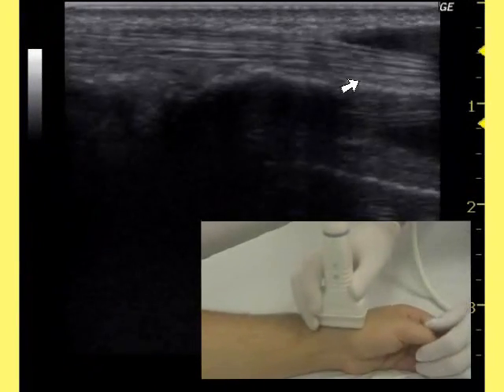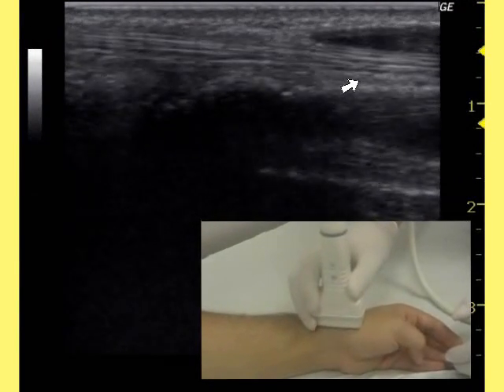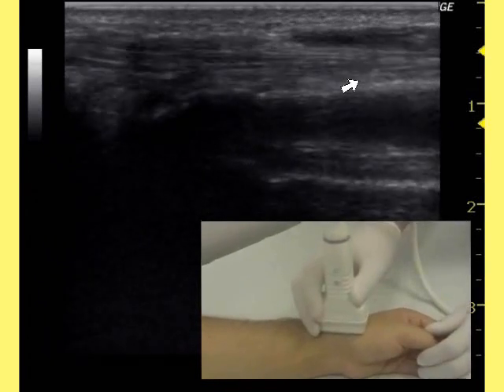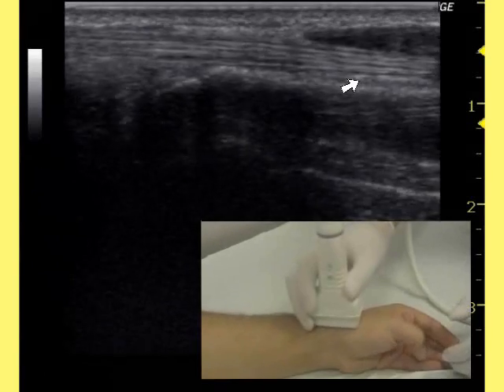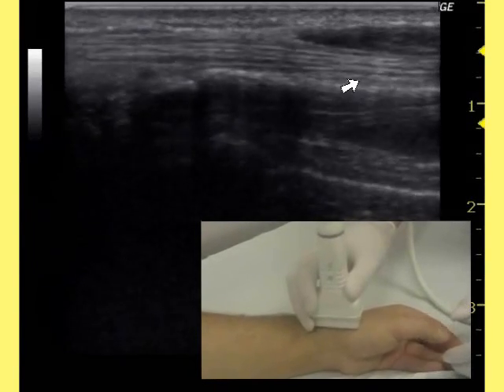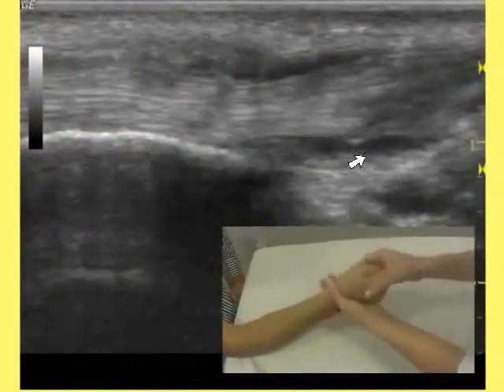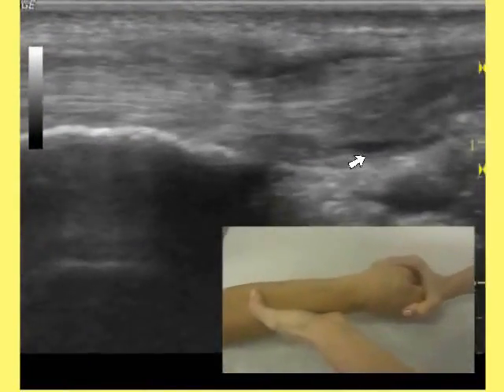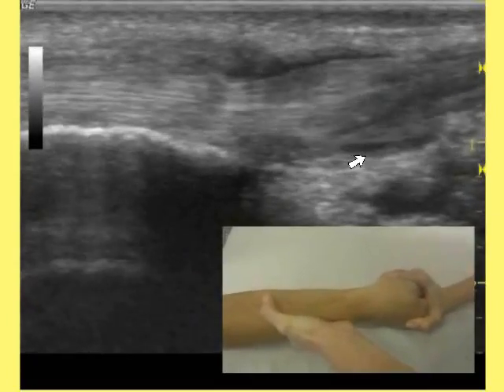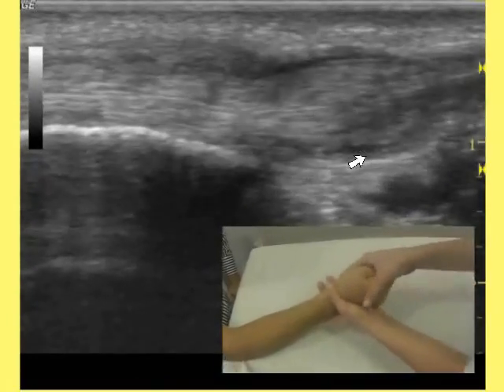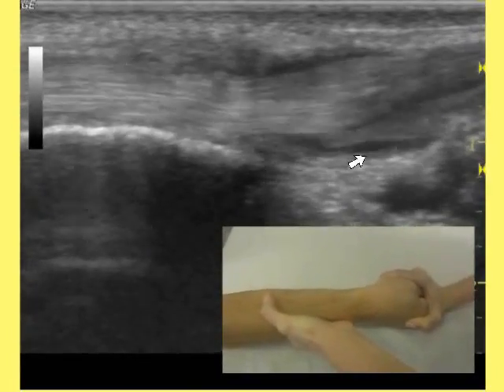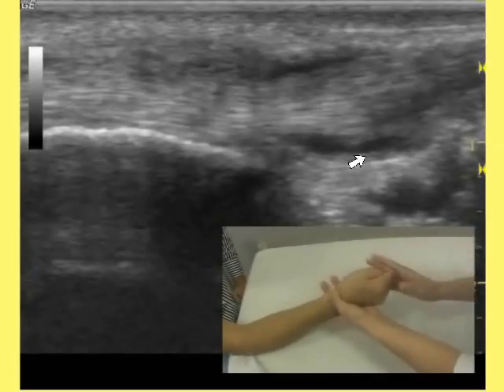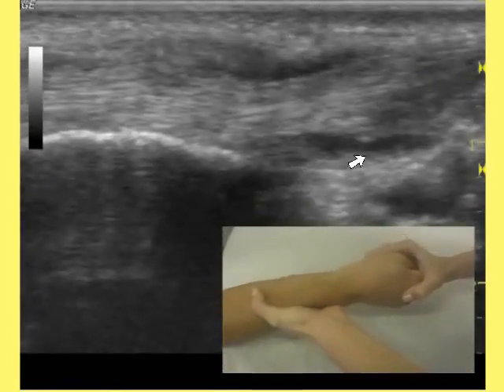Ultrasonography is the method of choice for the identification of the anatomy of the tendons of the abductor pollicis longus and extensor pollicis brevis muscles, and can confirm suspected De Quervain's Stenosynovitis. In normal conditions, tendons are free to move within their synovial sheath. The thickening of the extensor retinaculum of the wrist causes a conflict between the tendons and fibrous bone structures. Sagittal ultrasound shows a hypoechoic thickening of the synovial sheath. During the Finkelstein test, a conflict between the tendons and fibrous bone structures causes pain.